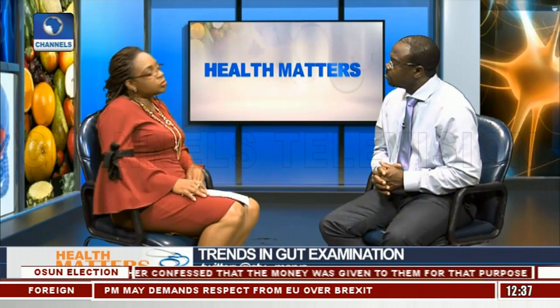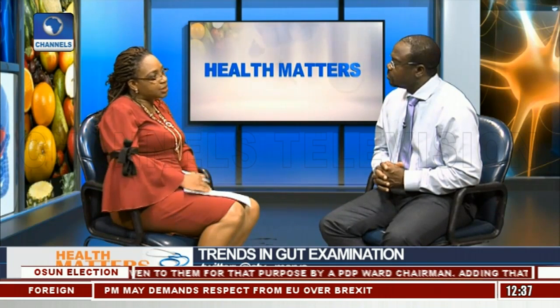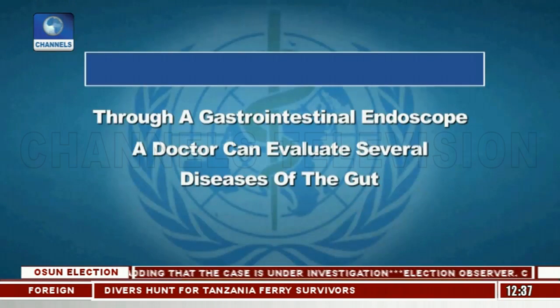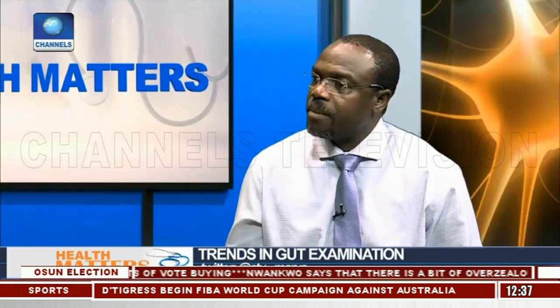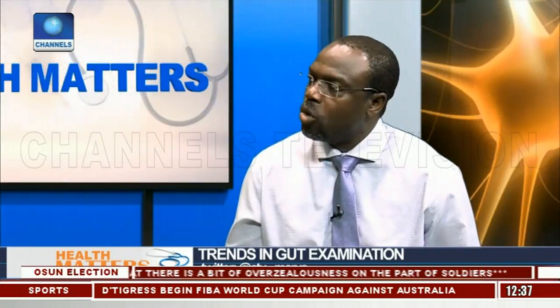Okay, so what kinds of diseases do you evaluate using a gastrointestinal endoscope? So a gastrointestinal endoscope will look at any disease involving the intestine, be it in the esophagus, the food pipe, the stomach, or the small intestine. And you also have scopes that are designed to look at the lower intestine.